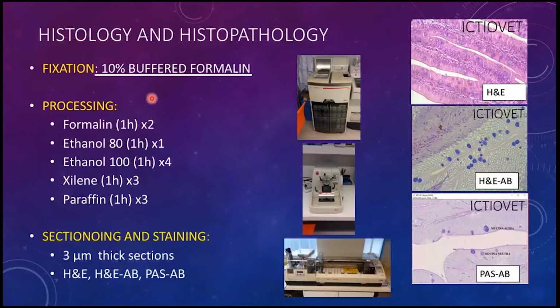Moreover, I would say that tissues like intestine are especially susceptible to postmortem artifacts. Intestines are one of the tissues that very easily start presenting artifacts, which makes it more difficult to take information and to analyze the tissues. So this fixation is very important.